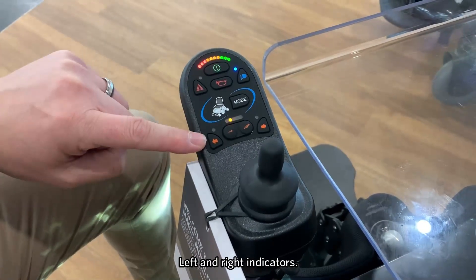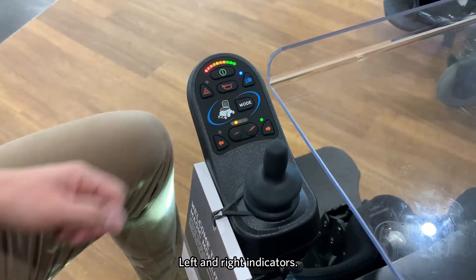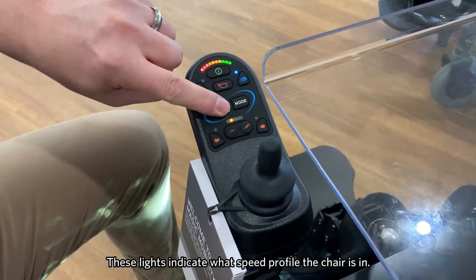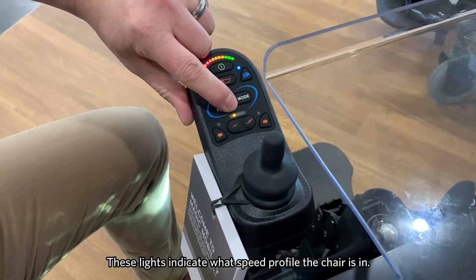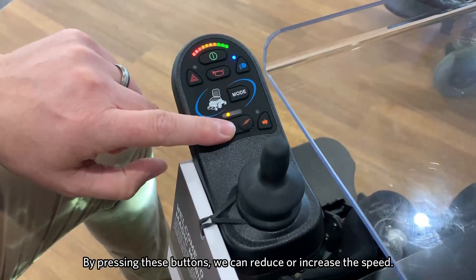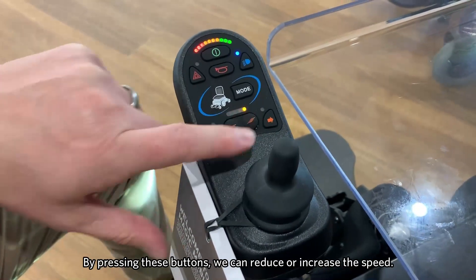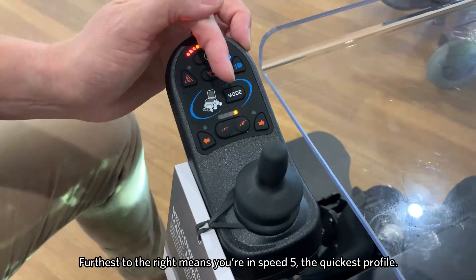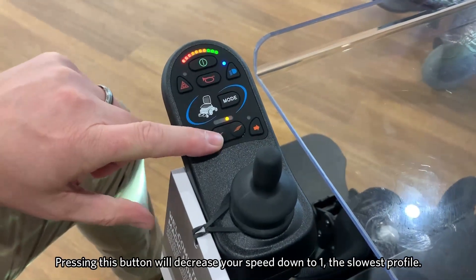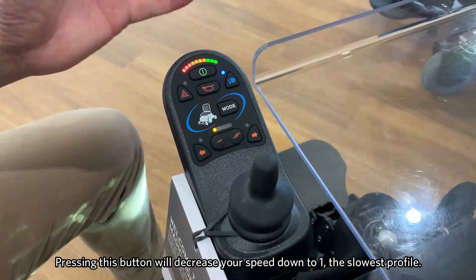We also have indicators on either side of the chair. Here we have the speed control of the chair. These lights indicate what speed profile the chair is in, and by pressing these buttons we can reduce the speed or increase the speed with each profile. The furthest to the right means it's in profile 5, meaning the quickest profile, and then as we press this button we reduce down to speed setting 1, or the slow speed setting.